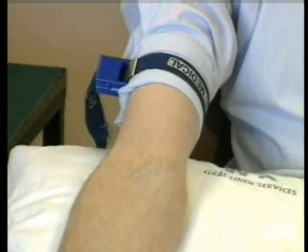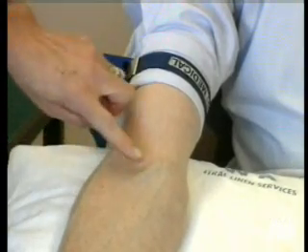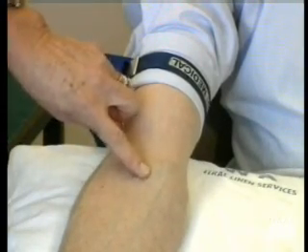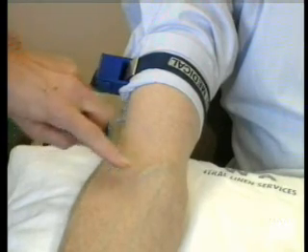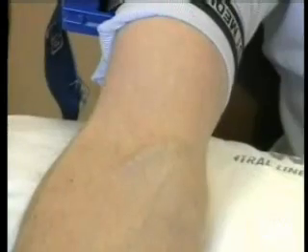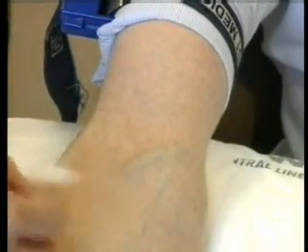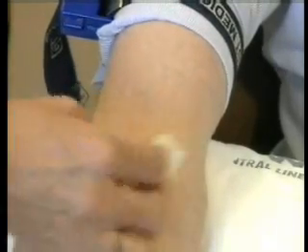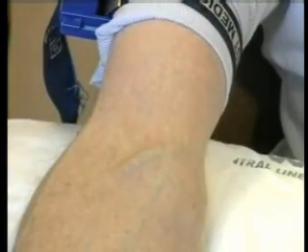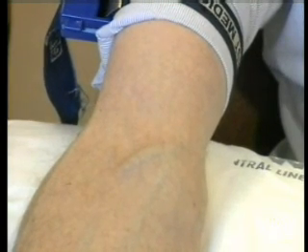The patient, meanwhile, clenches their fist to try and pump blood towards the venepuncture site. The next thing to do is to feel for the veins and go for the one which the operator is going to feel most comfortable with. You then swab the area with a spirit swab. This sometimes helps the veins to stand up.